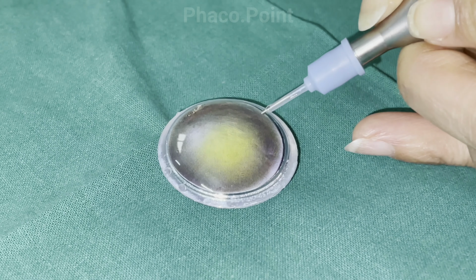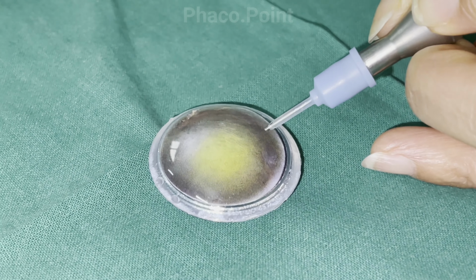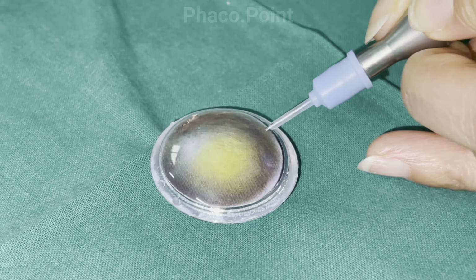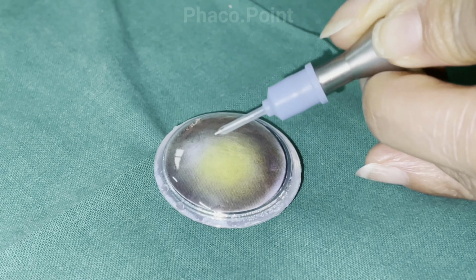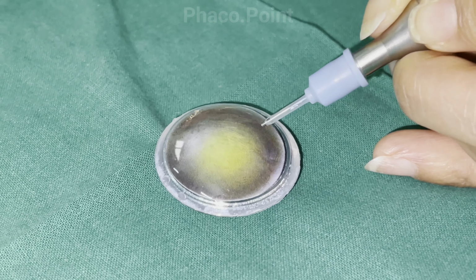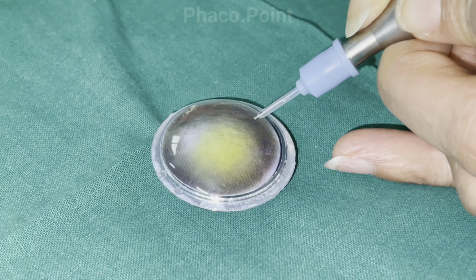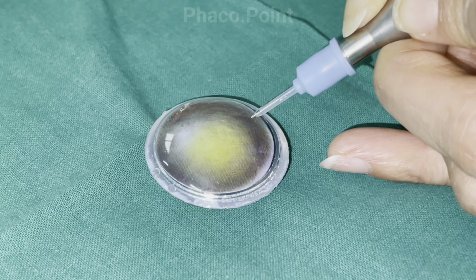Now that we have understood on a model eye the technique of direct chop, the power modulation, the foot pedal control, let's put it all together. So if we were to combine this with the foot pedal control, you're in the eye, foot pedal 1, bevel up, you've gone in foot pedal 2 and cleared all the cortex. You have an absolutely clear visualization of your line of burial. So in foot pedal 1, you remain. You focus on the anterior surface of the nucleus.